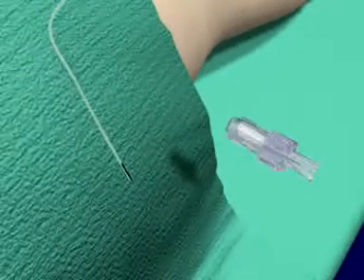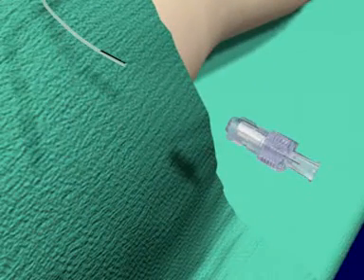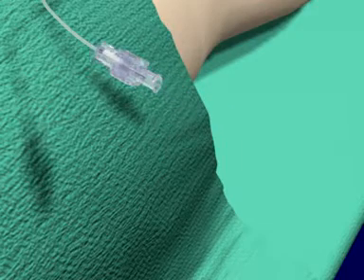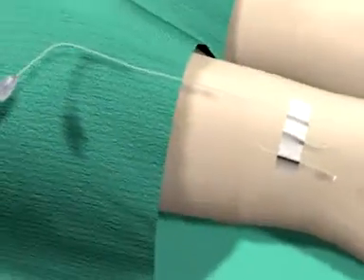Attach the catheter connector to the catheter by inserting the free end of the catheter into the connector cap. Tighten the cap until the catheter cannot be removed from the connector.